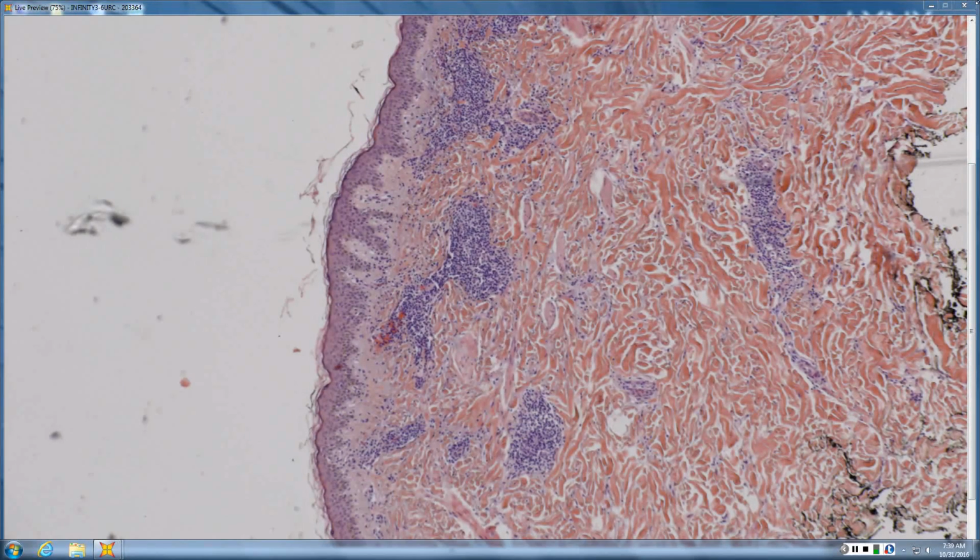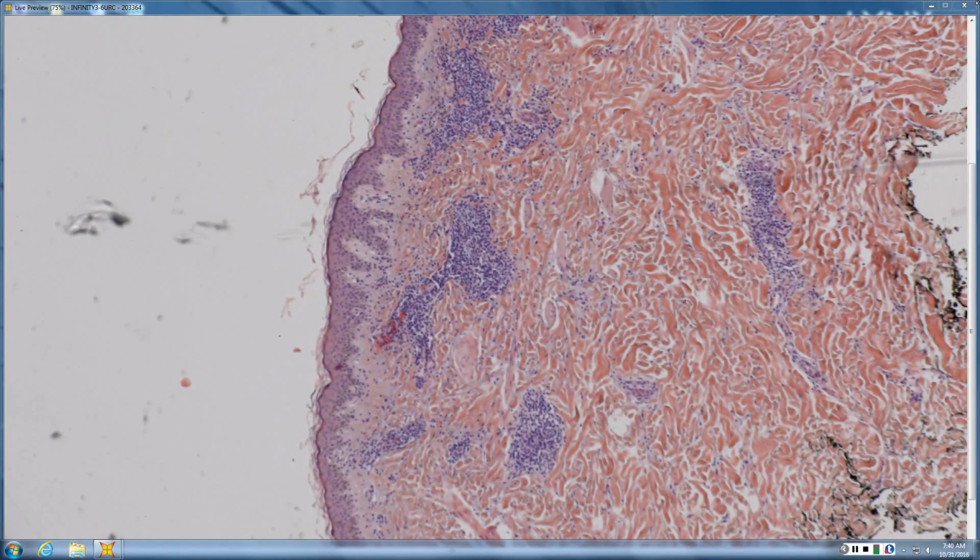Okay, back to this slide. If you were to roughly draw a shape around this, what kind of shape would you say? I would call it a wedge. A wedge, since it has a base there. We use that shape for all kinds of things. In inflammatory, it tells you that it's superficial and deep based on a central deep vessel. In melanocytic, broader at the top, like a triangle with the point at the bottom, is usually benign, whereas the reverse of that is usually malignant.